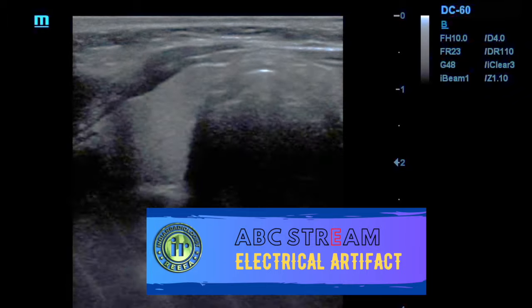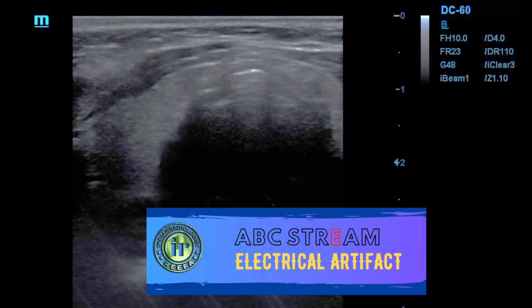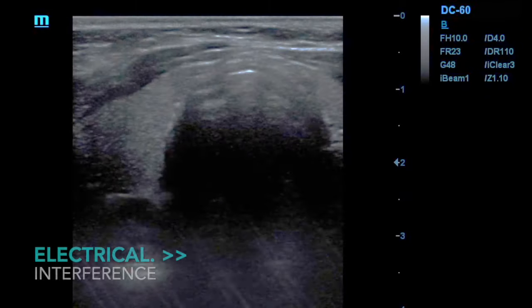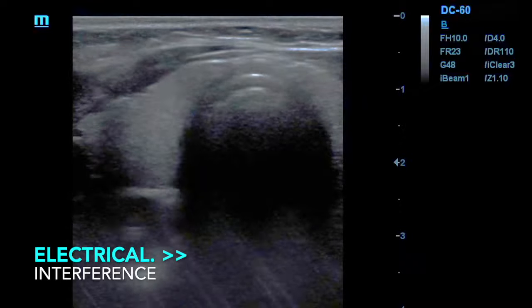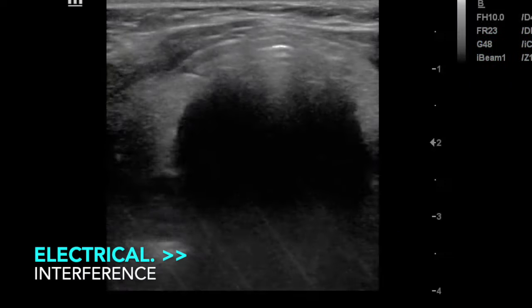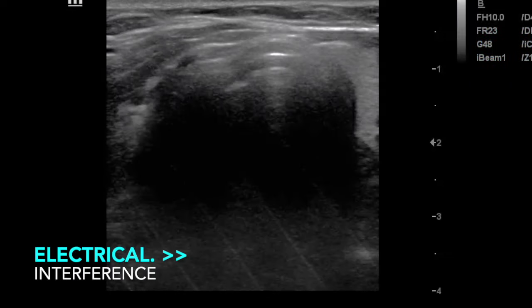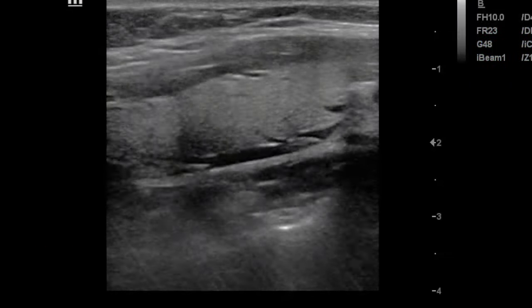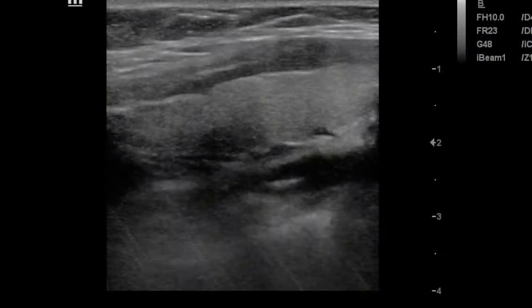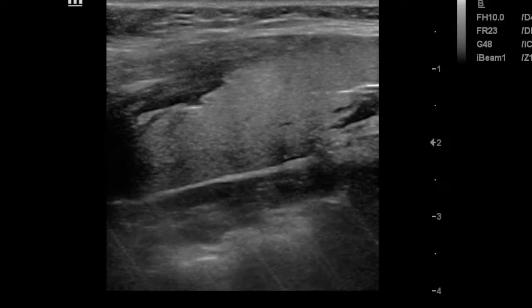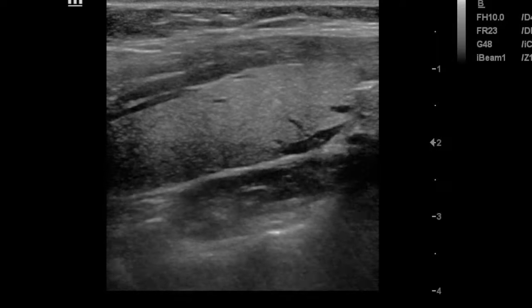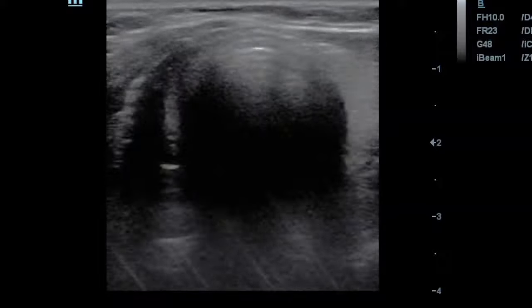Electrical interference is caused by problems in the machine output, such as voltage fluctuation, frequency fluctuation, or interference from adjacent electrical machines operating at the same time as the ultrasound device. On video it appears as linear lines at the distal part of the screen.